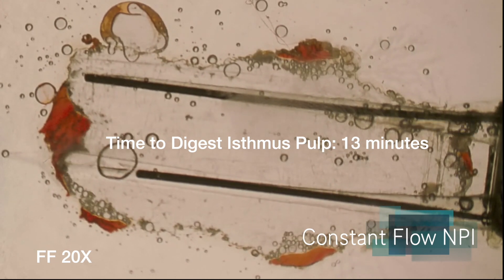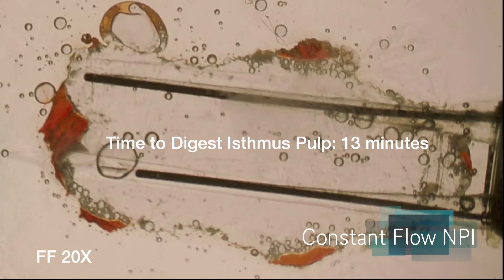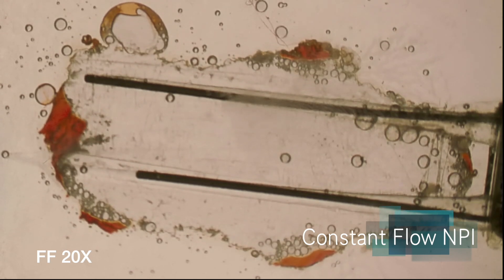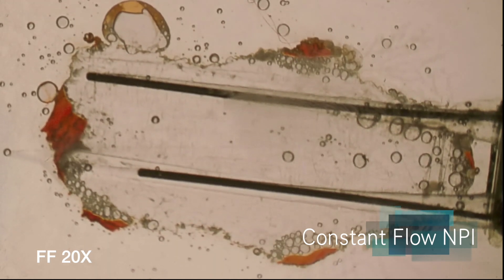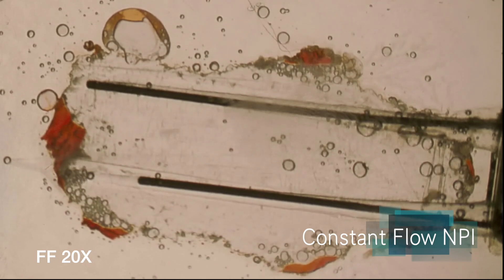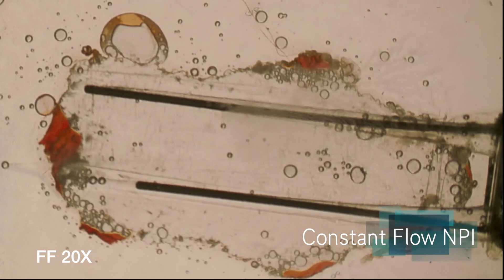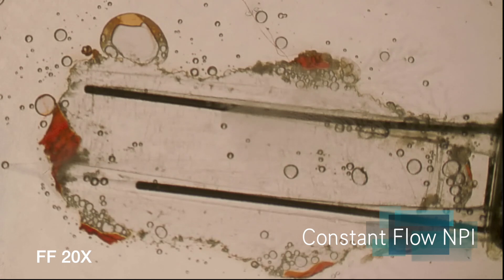Simply because there's fresh solution, slow flow, but fresh solution during this whole period of time. Now look at the negative pressure irrigation actually removing pulp tissue beyond the end of the needles.